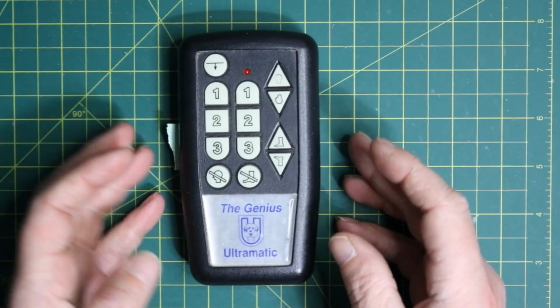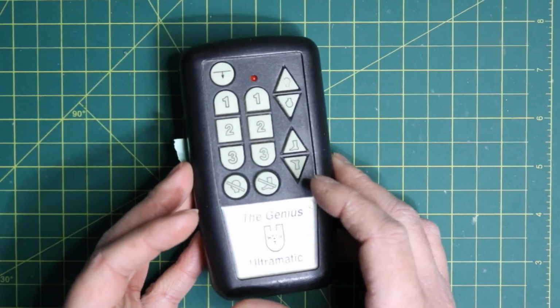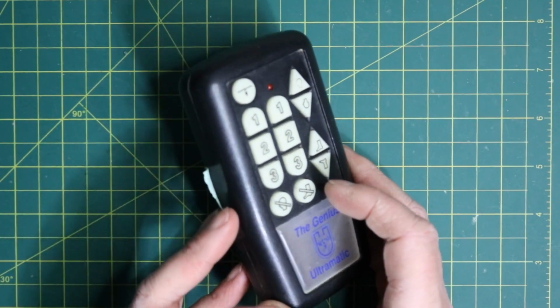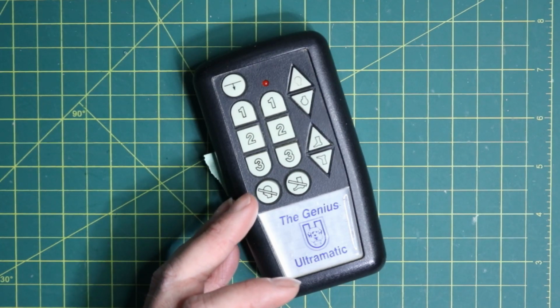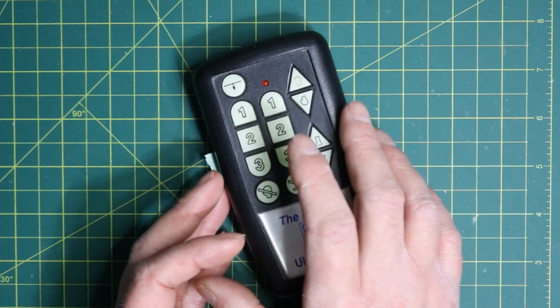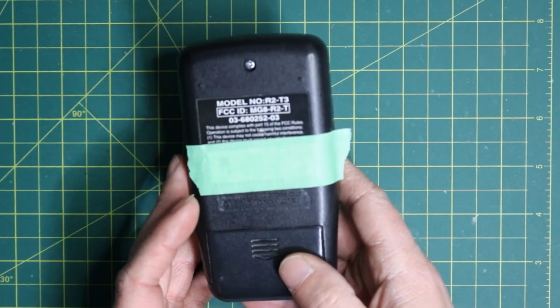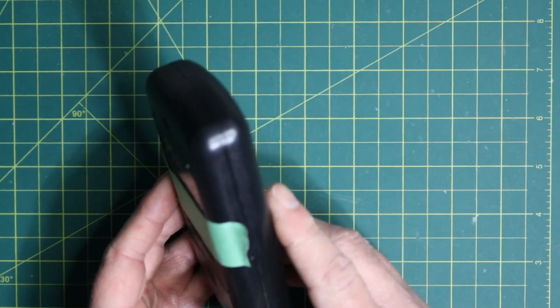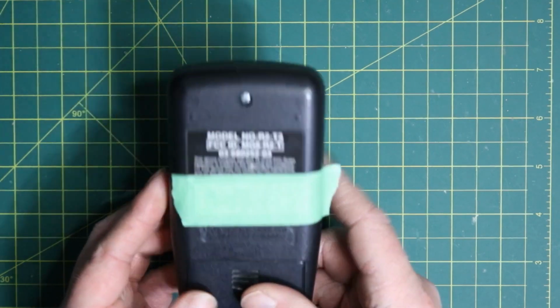Okay, good day. Today we're going to be looking at the Genius Ultramatic RF controller for a hospital bed. It came to me a few times in the past, and today we're just going to do a really good deep cleaning of the inlay, as well as the main board. Now I am trying out a new software to see if it's actually going to work properly.